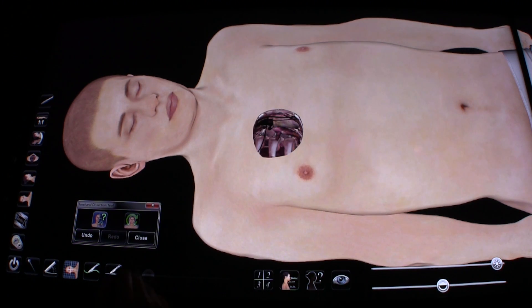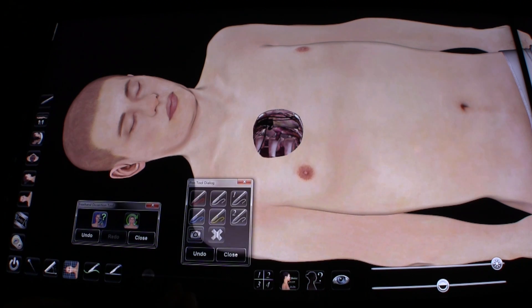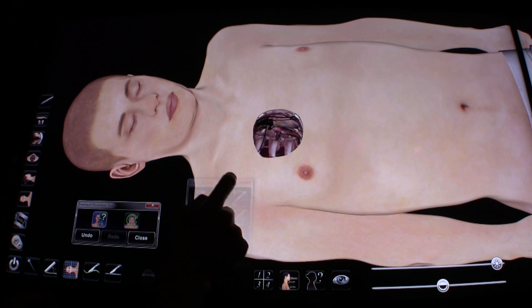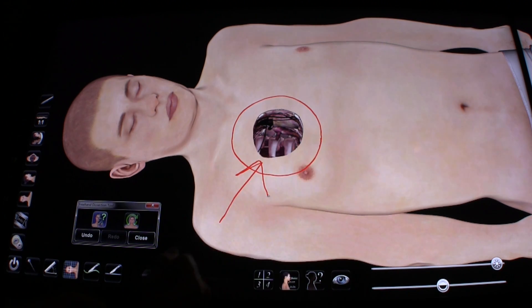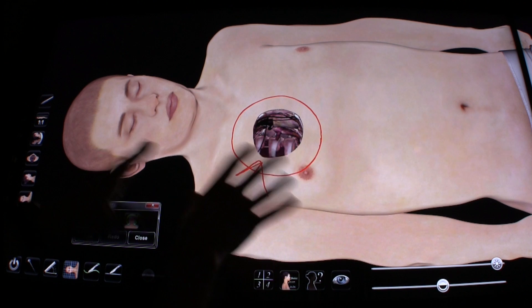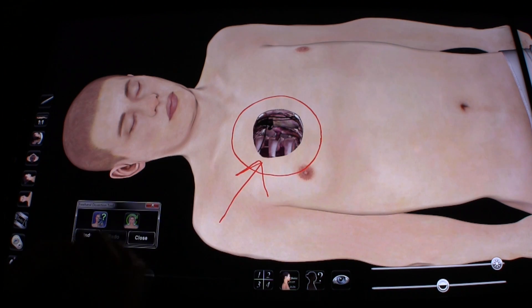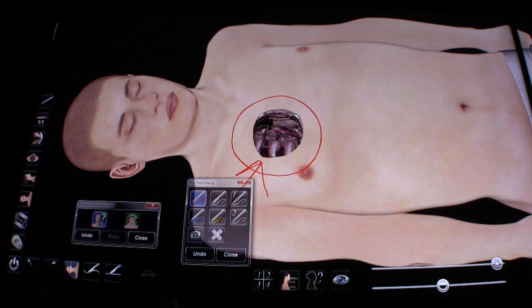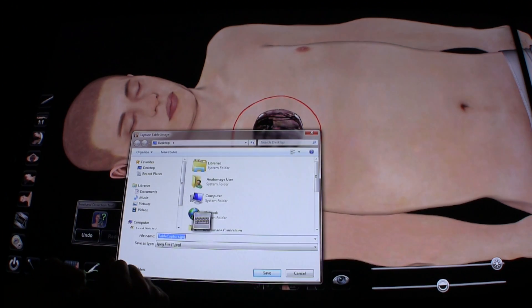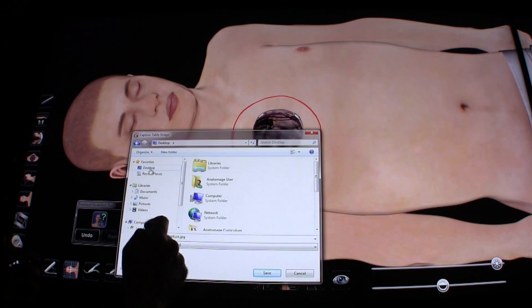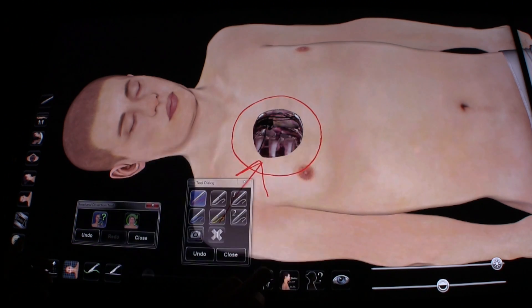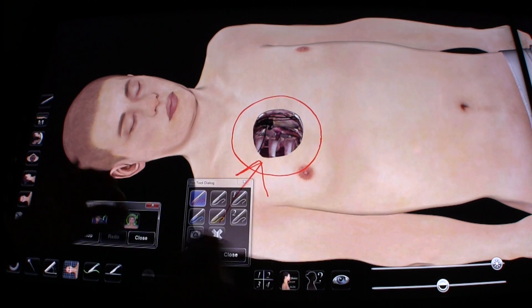Before I stitch it back up, I'm going to show you a couple of other tools. Up here in the top left-hand corner we have the pen tool. It opens up a window and there are a variety of colors available. If I choose the red pen, I can now draw on the table and it allows for very easy annotations. If I want to take this image with me — say I want to show it to my students or it was a homework assignment — I can load the pen tool again, and in the bottom left above the undo button there's a camera that takes a screenshot of whatever you have on the table. The Anatomage Table has three USB ports on the side, so you can plug in a flash drive, select it from the left-hand side, hit the save button, and now that image has been saved to your flash drive.